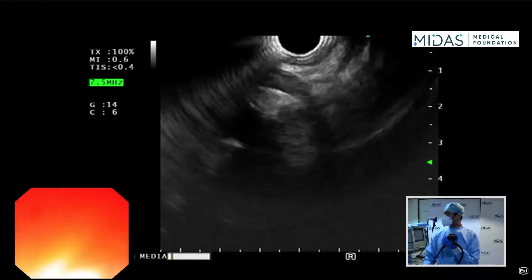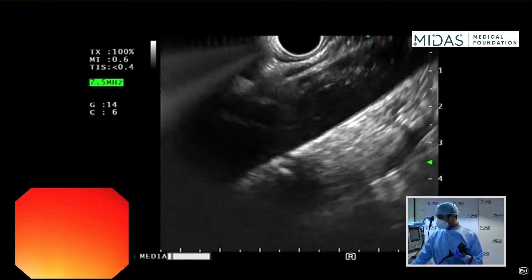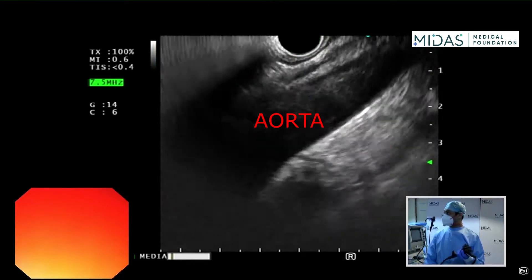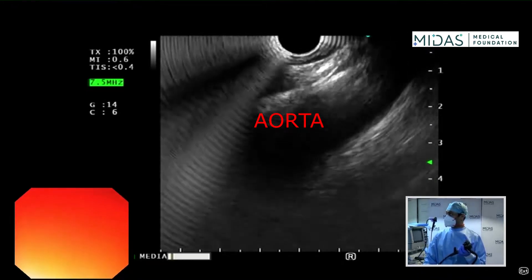I push the scope and move it back and forth gently with my big wheel towards me. I'll show you with the Doppler. These are the pulsatile sensations of the aorta as I push the scope down.